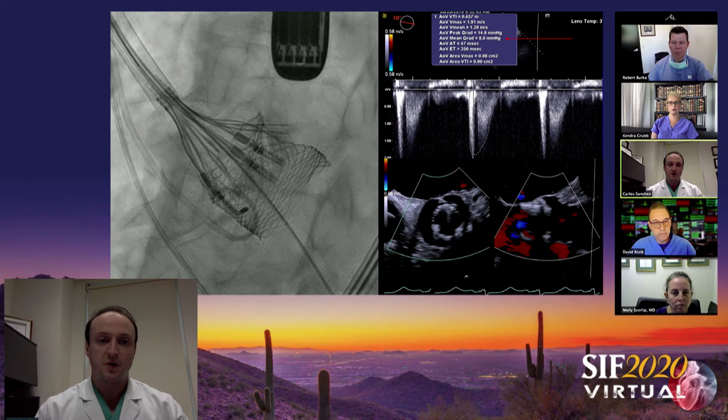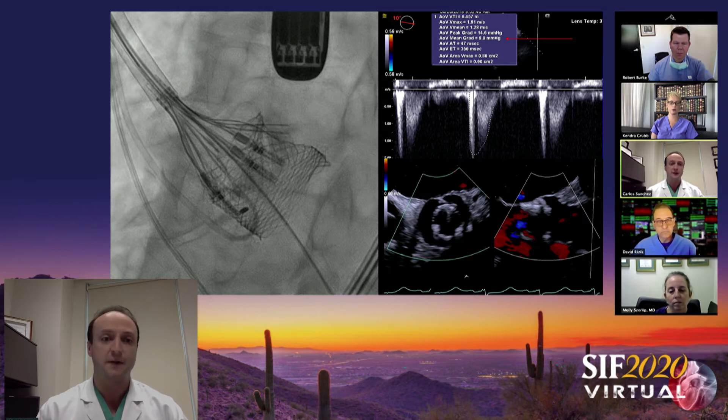Not more than a week later, this complex bicuspid anatomy — you can see the baseline gradients, real classic bicuspid anatomy with heavy calcification. Again, a pretty serious indentation of the braid frame. We resheathed and redeployed and got a very nicely expanded device. Carlos, the potential of mechanical valvuloplasty with this technology is amazing. There's no concern because the leaflets are not sewn into the braid frame of the valve — they're attached more to the posts. So deformation does not affect valve function or increase gradients.